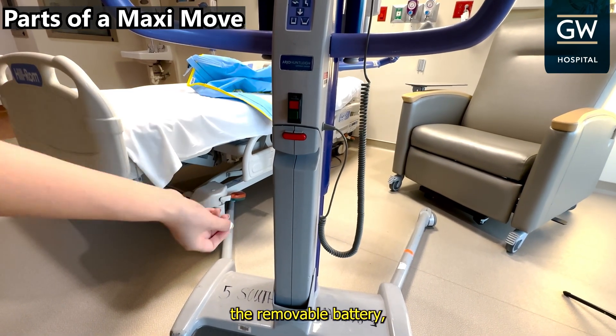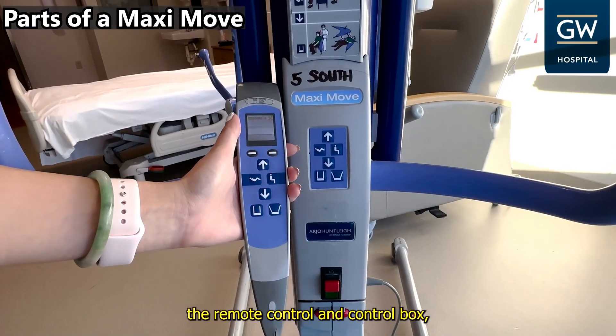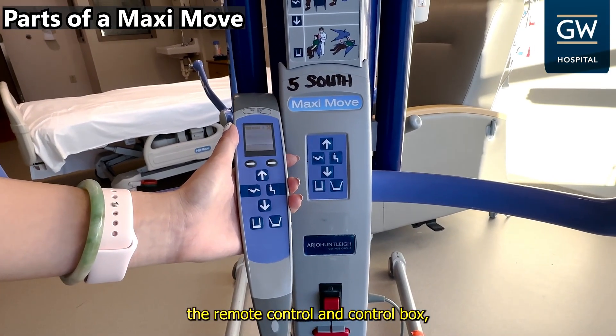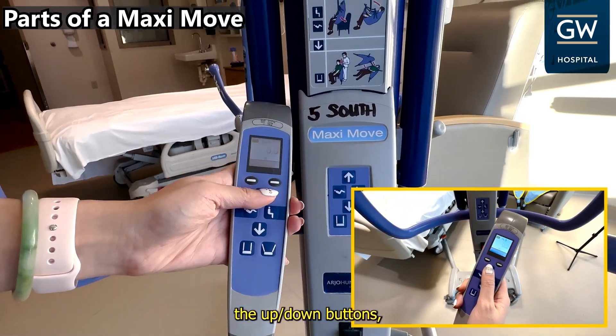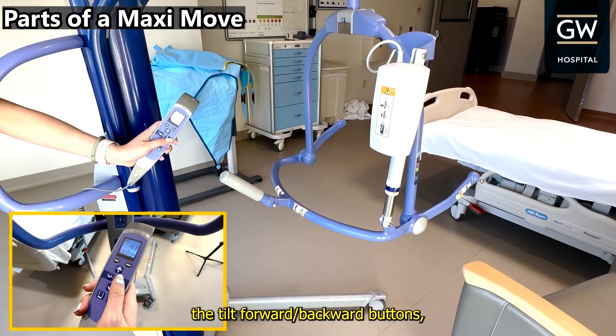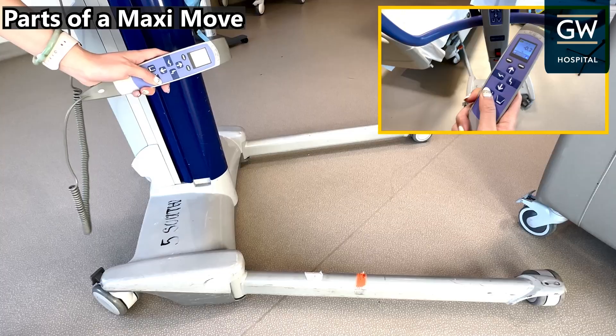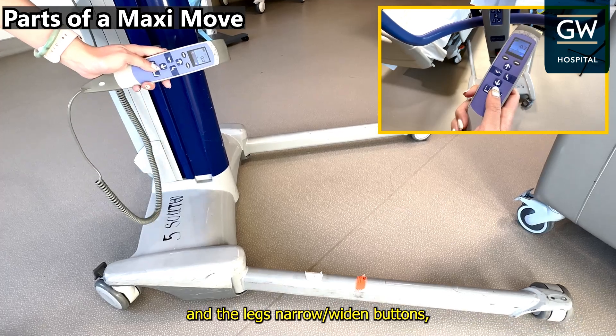The on-off switch, the removable battery, the remote control and control box, the up-down buttons, the tilt-forward and backward buttons, and the legs-narrow and widened buttons.